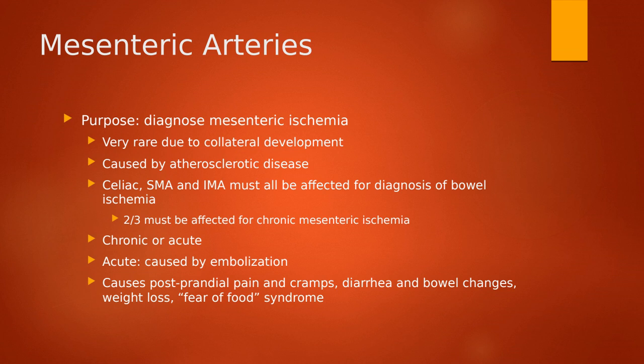There are a lot of anti-rejection medications that people can take, whether it be a kidney transplant or a liver transplant, heart transplant, but sometimes you just never know. So now moving away from our kidneys and moving more into our abdominal evaluation, we know how to do standard abdominal Dopplers, right? We do our main portal vein, our hepatics, left to right portal vein, hepatic artery, splenic vein. We know how to do all of that stuff, but there are also different arteries in that ballpark that you probably haven't seen performed at clinic.